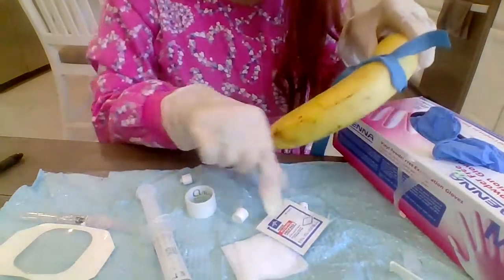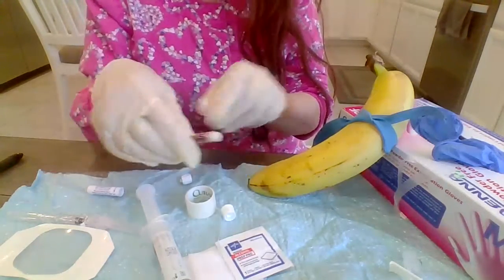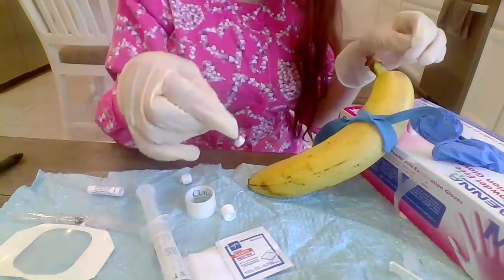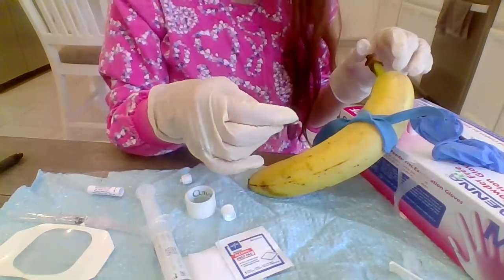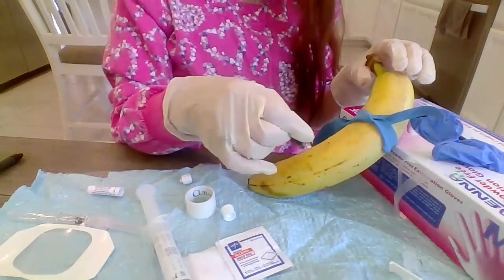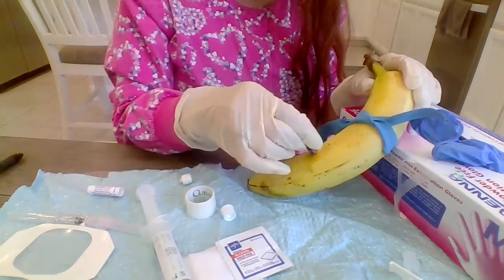Let's see here. I'm going to go ahead and open this and then break it, and then let it soak. Now I'm going to clean the area in a circular motion from inside to out.